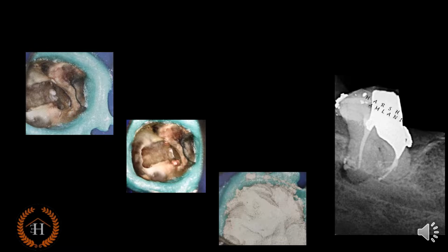This was added layer by layer and a wall was formed till the occlusal surface. Once that wall was formed, the rest of the endodontic access cavity was packed with amalgam and allowed to set for 15 to 20 minutes. After the initial set of amalgam, this band of resin matrix was chipped off using an explorer, or you can even use a finishing bur.